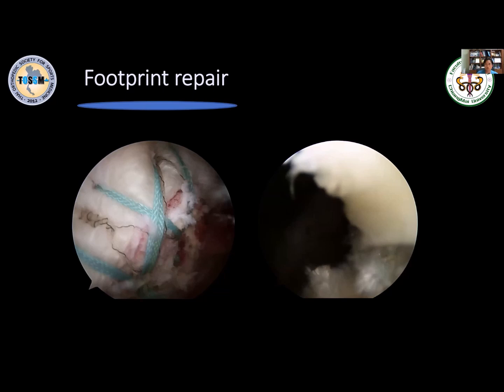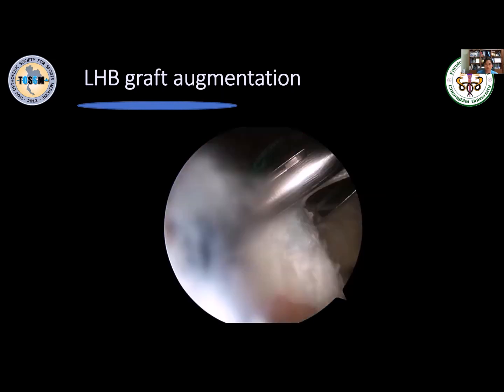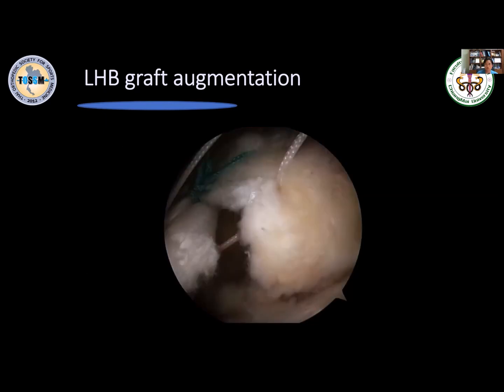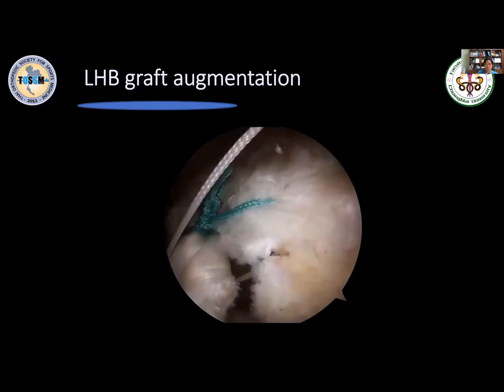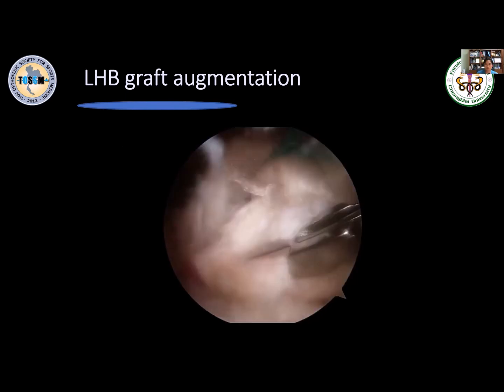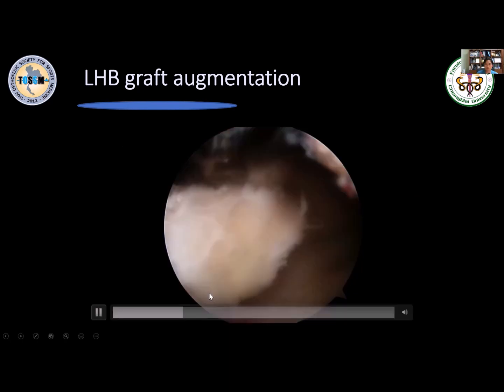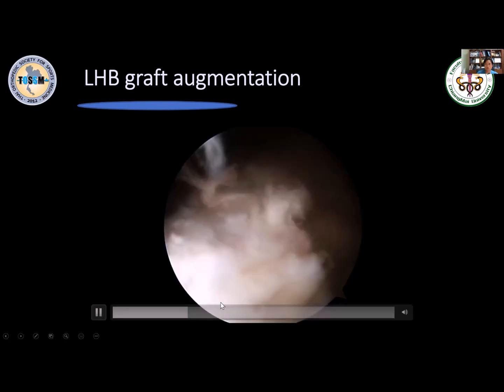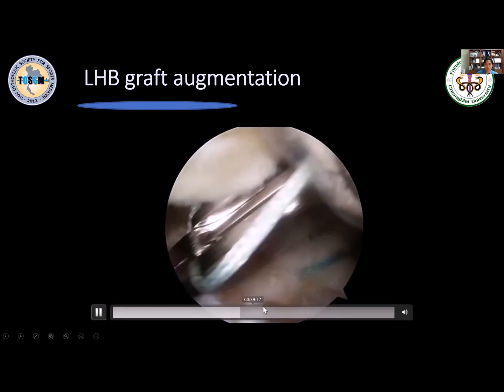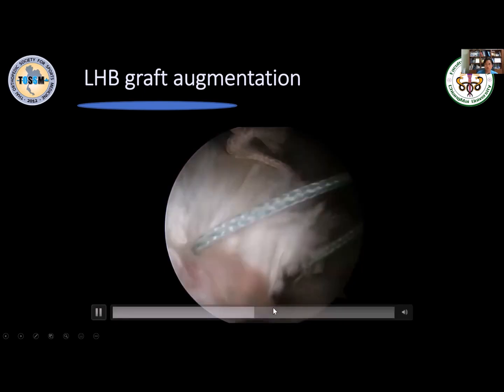So what we did, we cut the bicep distally as I showed. We stitched it to the graft, stitched it to the anterior part of the supraspinatus, like that. We stitched it about 4 or 5 stitches. Now we stitched the end to the infraspinatus right there. Like that, we did something like that for another 20-30 minutes. So we stitch almost 360. Now we stitch to the back like that.